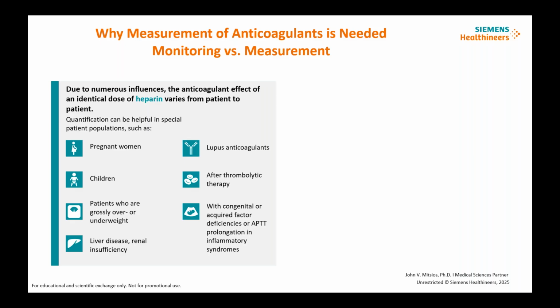Or if we're looking at unfractionated heparin, we know that a target heparin therapy is between 0.3 and 0.7 units per ml. And measurement is really giving us a quantity, right? So we don't really have an established therapeutic range, but we need a value to determine whether or not, in this particular case for the DOACs, the administration of the antidote is indeed appropriate.